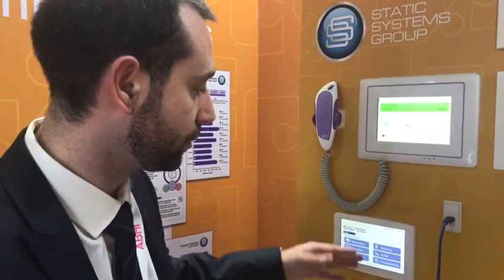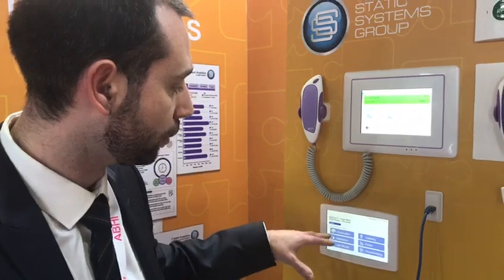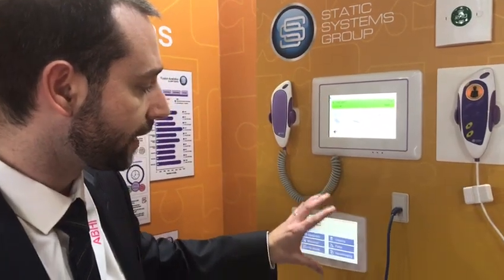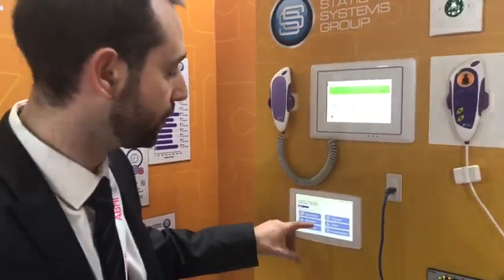By going into the workflow and task management, if another service is required by the patient, such as catering or a porter to take them to x-ray, etc., medical lab results or observations, they can be raised on the system from this terminal.